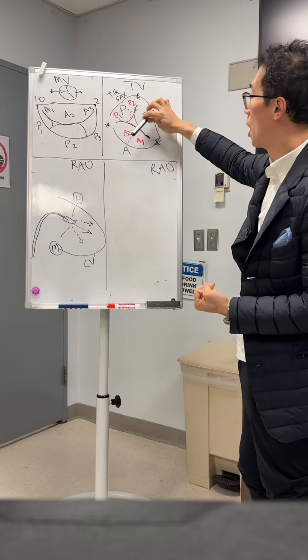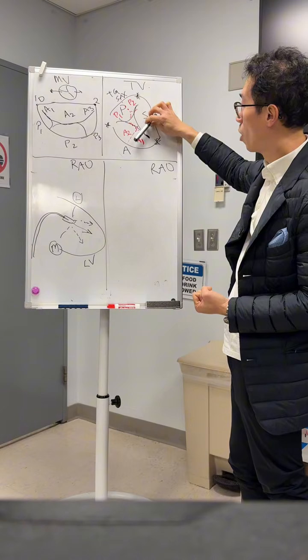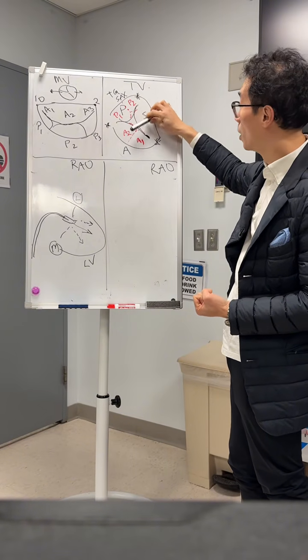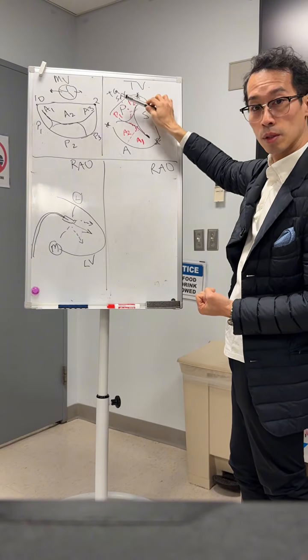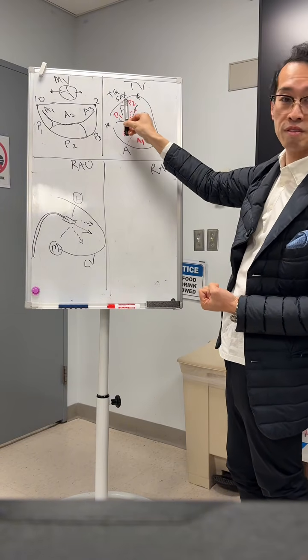And so now, in the same language, the clock face orientation, if you're going AS, you're probably going this way. PS will be going this way. We rarely do AP. That's not really what we do. That's been shown not to be effective.